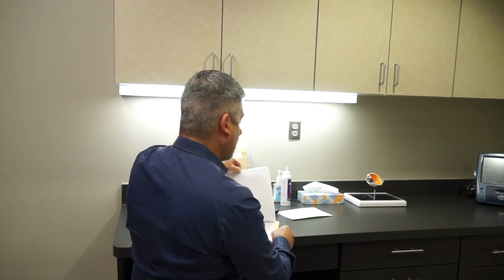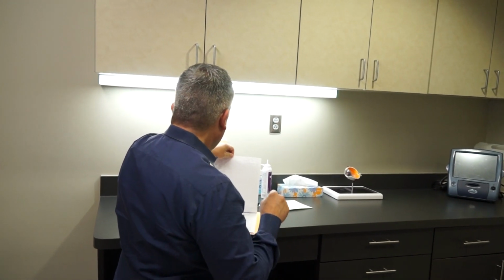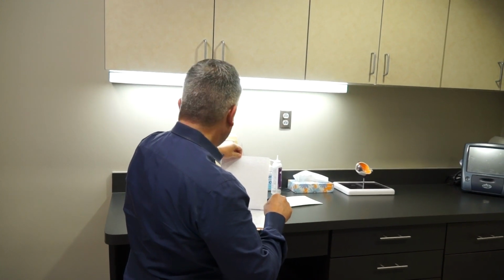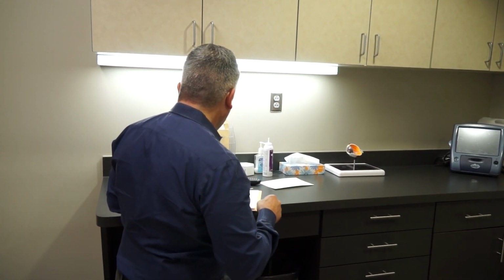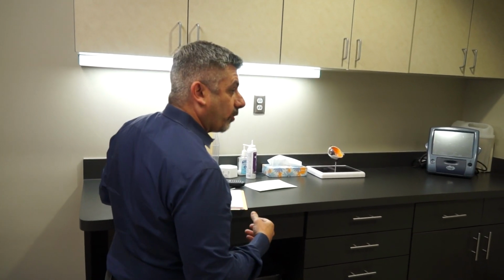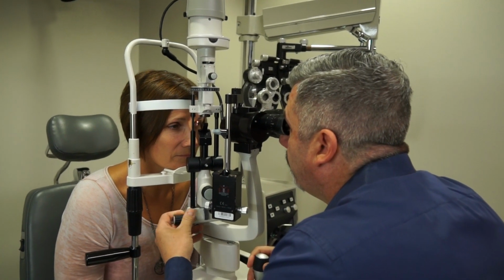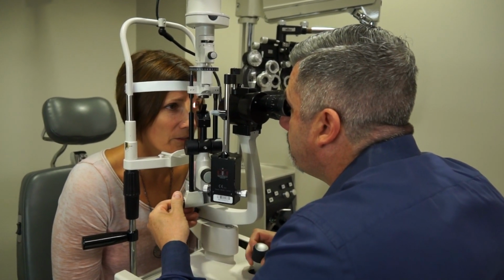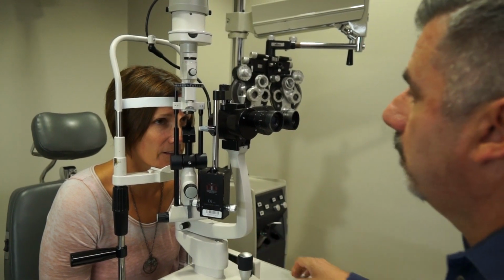Your left eye was the worst eye to start with. It was always your much more nearsighted eye. So your vision with your active focus on day 1 after surgery was 20/20 minus 1 letter. And so your vision with the PanOptix today in the left eye is 20/20. So your vision in your right eye got better over the course of the month. I'm sure your vision in your left will as well. But remember, your left was never a good seeing eye. It was always more than twice as nearsighted as the right. So 20/20 for distance with your left eye, 20/12.5 for arm's length computer, about 24 inches away, and 20/20 what we call J1 plus for reading.